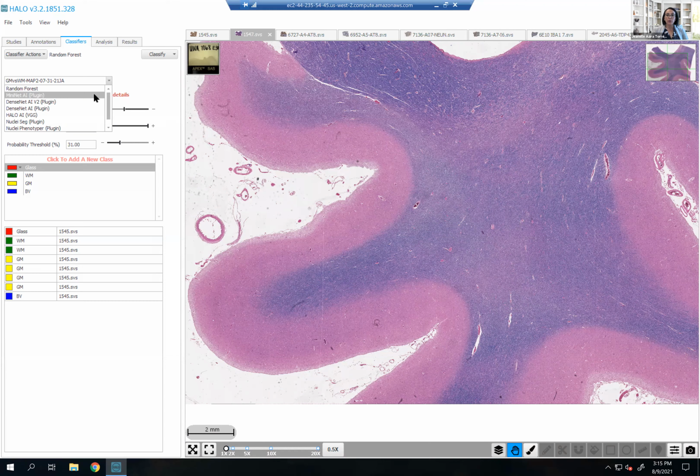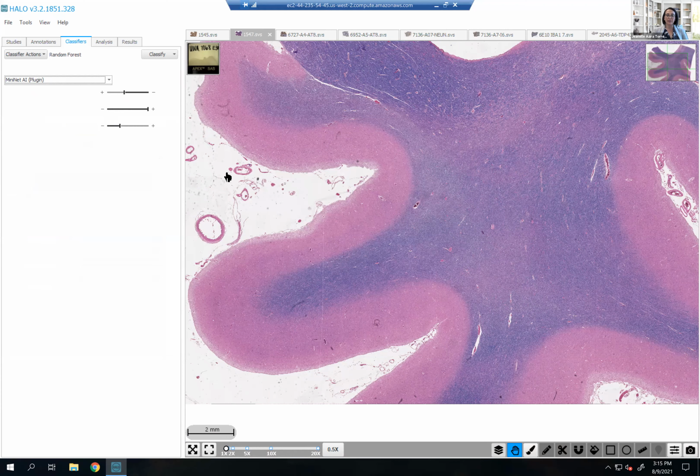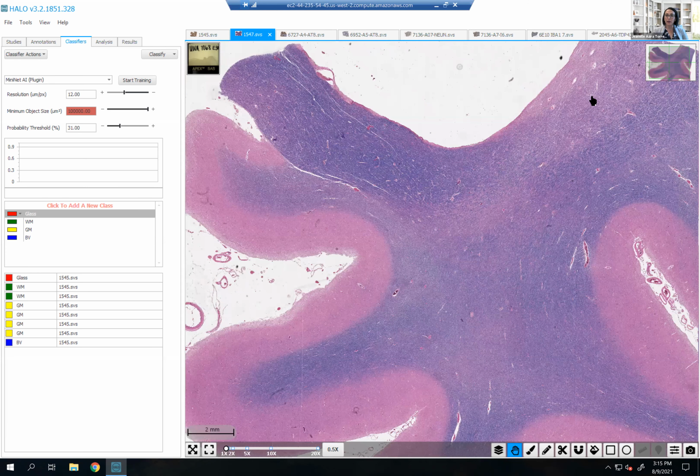The best way to go with this approach is the MiniNet. MiniNet is a deep learning approach. With this one, I can differentiate those regions and I can feed the system with more data, because in deep learning, the more data, the better. However, MiniNet, as its name indicates, has certain limits. For example, if I wanted to analyze the white matter and include this in the white matter, telling the computer that this is the white matter, but it's a little bit pale.